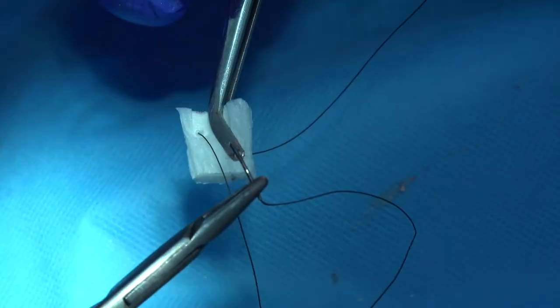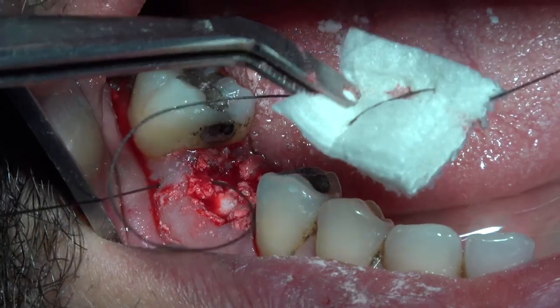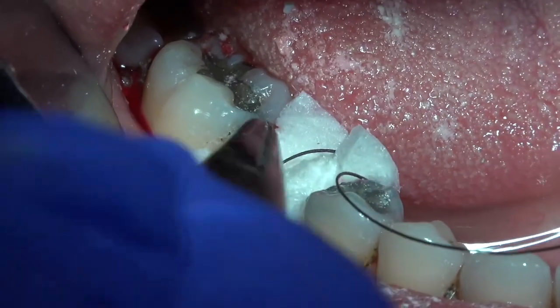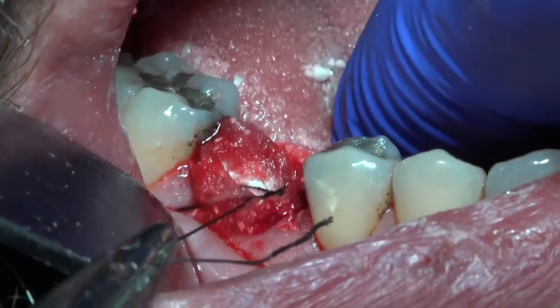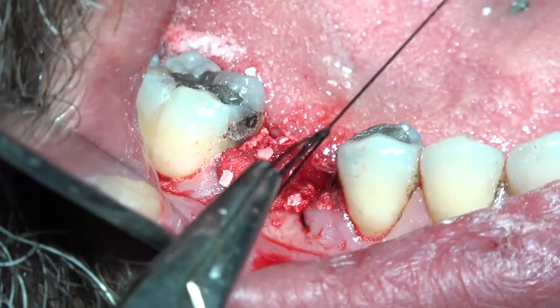First we do it outside the oral cavity so that the sponge will not get wet, which would make it much more difficult. Then, as you can see, we insert the needle into the buccal aspect and then into the lingual aspect and make our first suture. After that, with criss-cross suturing above it, we stabilize it in place.